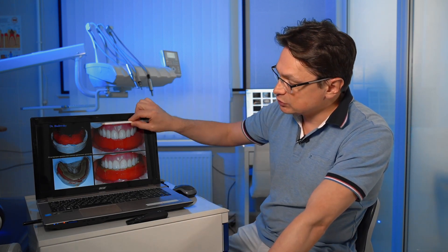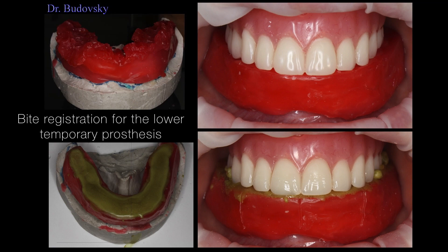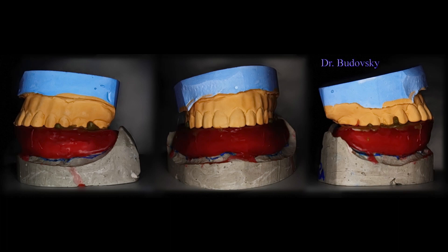Next I perform the registration, and in this case with temporary prosthetics, you see that complex patients often require more than one registration — we double-check ourselves. When registering the central relation initially it is difficult to obtain it, especially if the patient has some dysfunction problems — you'll likely get it at RP1. The stages of pre-prosthetic preparation, when you sequentially proceed from temporary to permanent prosthetics, allow you to eliminate spasm, pain, and different problems, and obtain the most accurate jaw relation before doing permanent prosthetics.